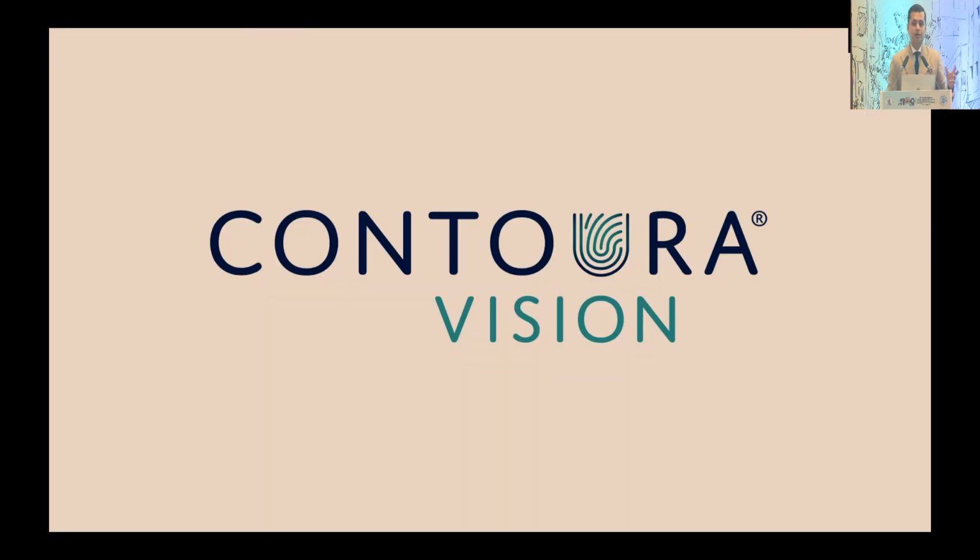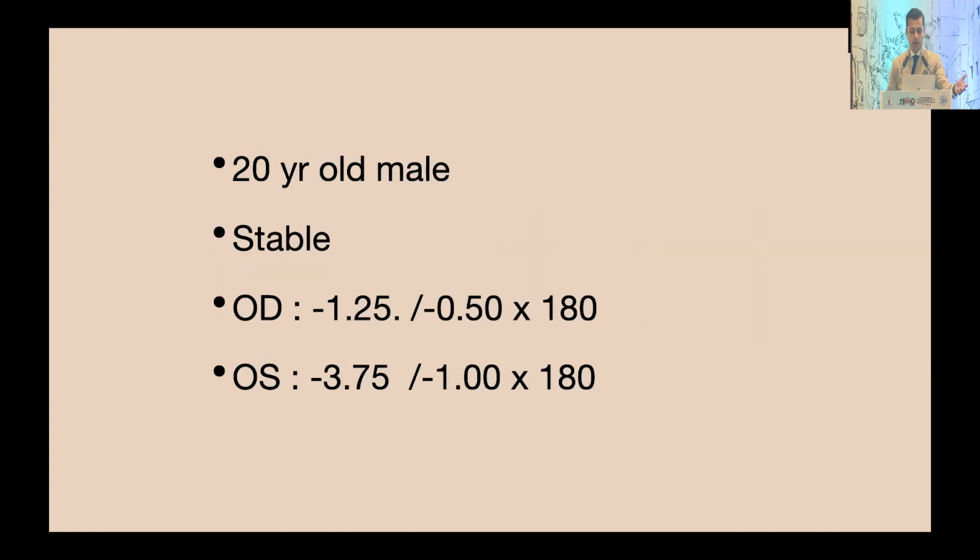The question is, what happened? We looked at the topography and we treated the cornea based on topography. Now, later, a few years down the line, it started coming up as what is known as Contoura vision or topo-guided treatment. So we all realized that what we could do with bad eyes, we could do much better with eyes that are pristine and good. Not only treat the numbers, but make their corneas better.